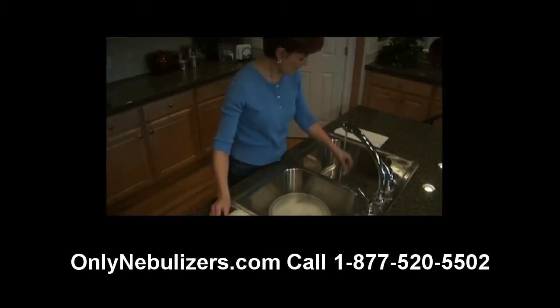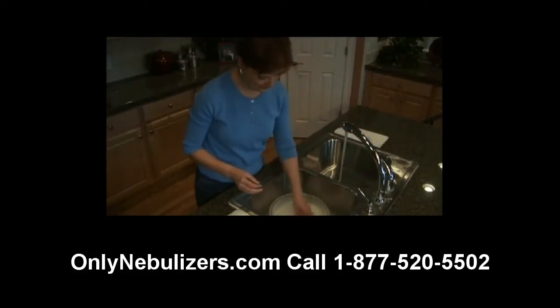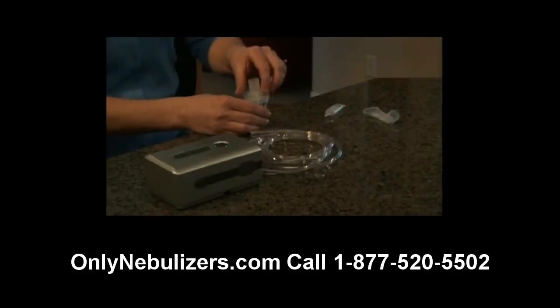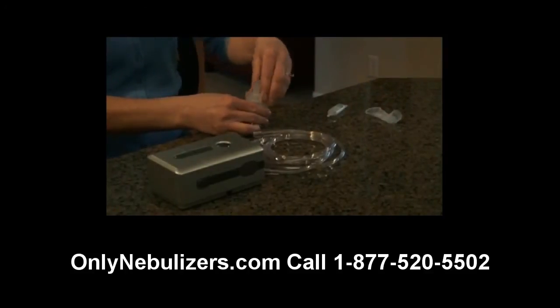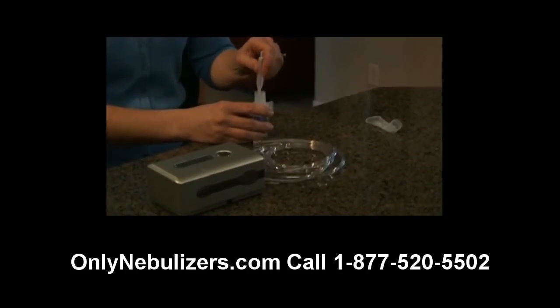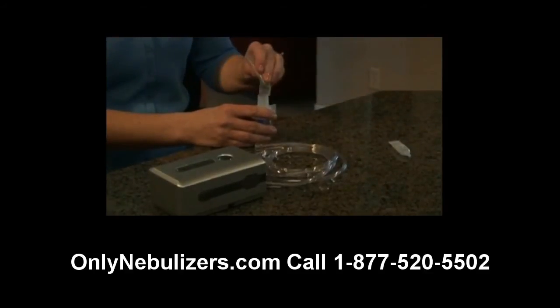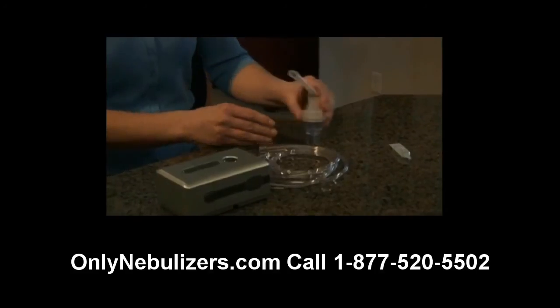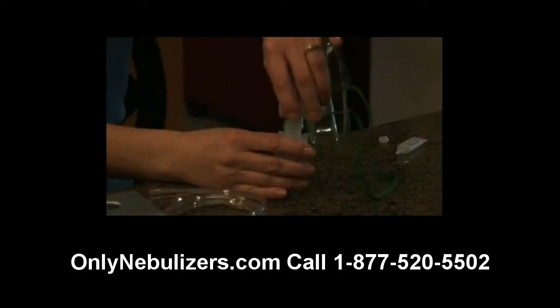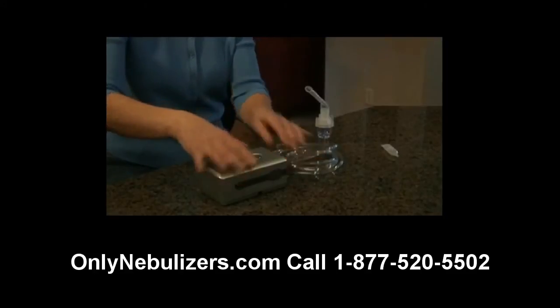Before you use your nebulizer for the first time, clean all parts by following the instructions provided later in this video. After washing your hands, insert the baffle into the nebulizer medication cup. While holding the cup, attach the nebulizer cap by turning clockwise. Next, add the prescribed dosage of medication into the nebulizer through the large opening in the top of the nebulizer cap and attach the mouthpiece to the cap by pushing gently straight down. If you're using an aerosol mask, place the mask adapter directly into the top of the nebulizer cap. Finally, attach the tubing to the nebulizer air inlet connector.